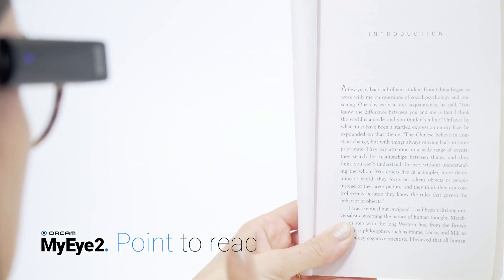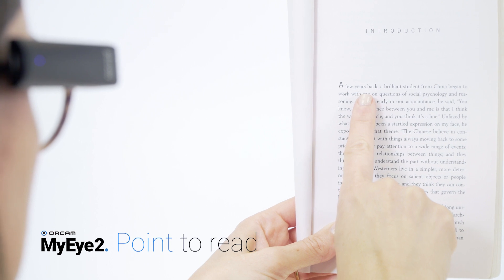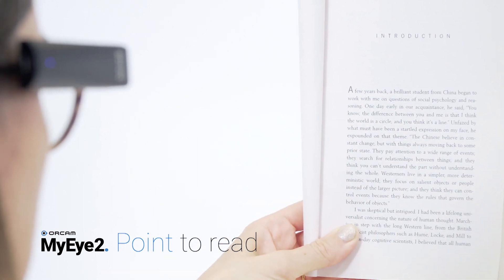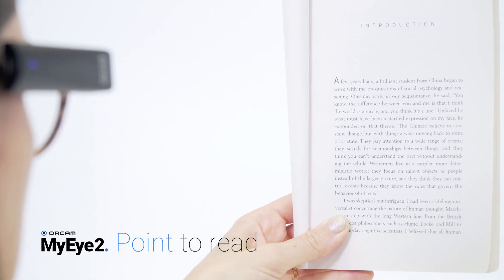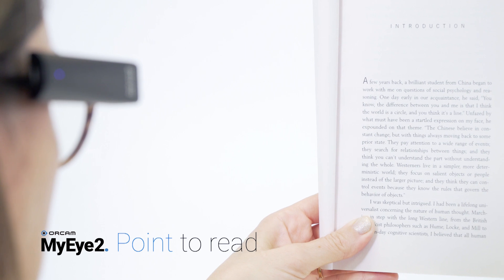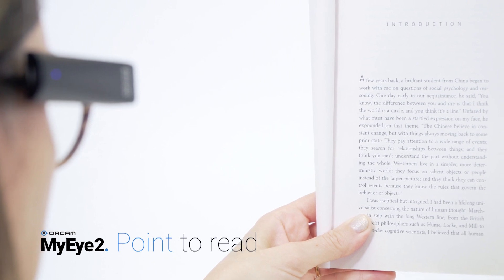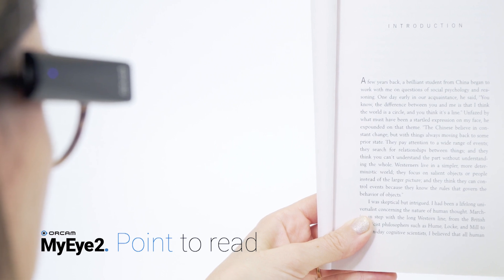Point at the text with your pointing finger extended upwards and fingertip facing the page. You will hear a double beep sound indicating your finger has been detected. Remove your hand from the text so that the camera can capture it. Now your device will read the text to you from the top of the section to which you have pointed. When it has finished reading, the device will sound a chime.